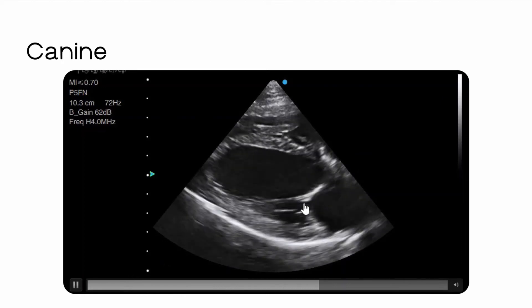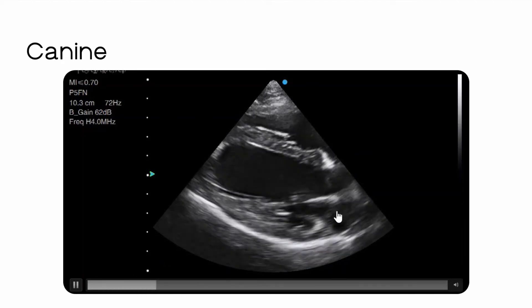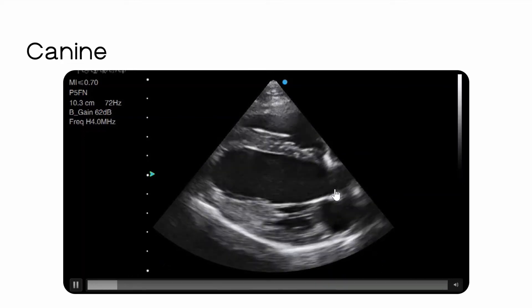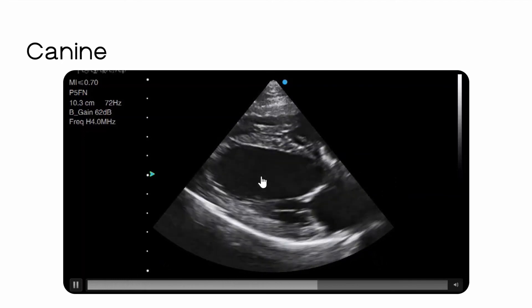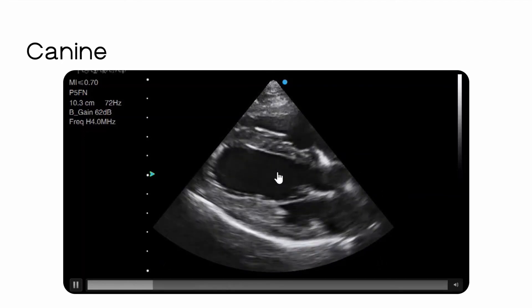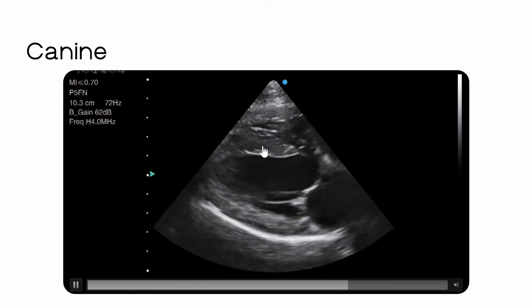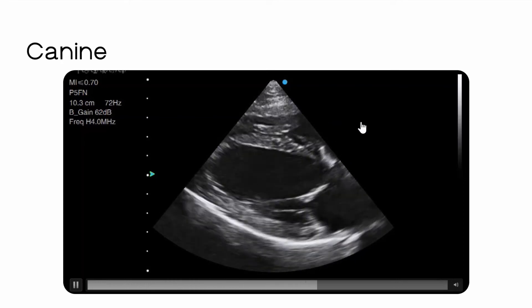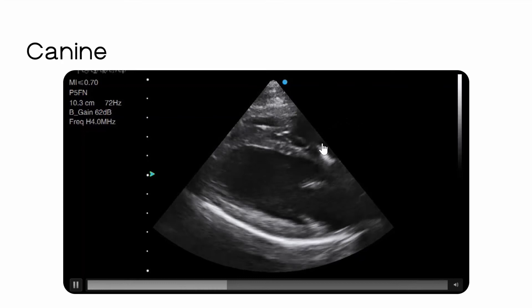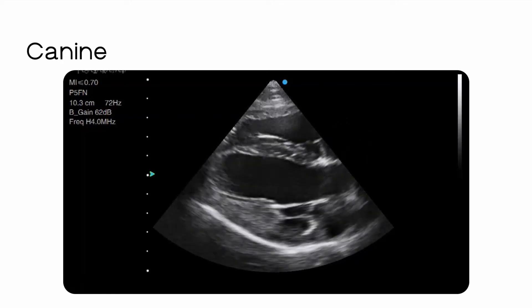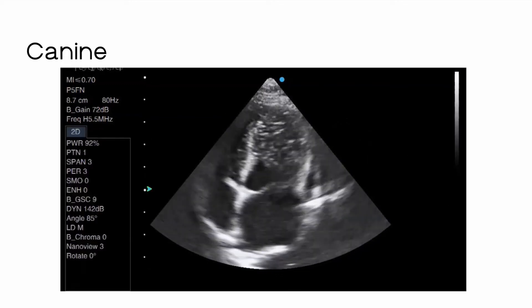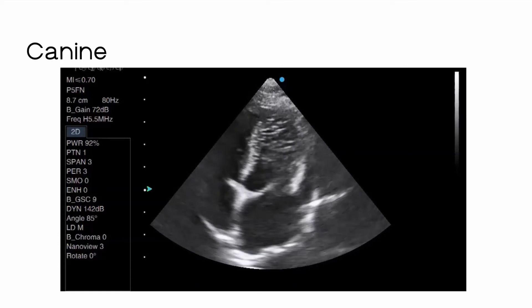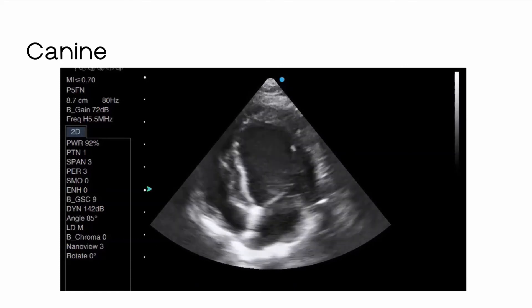So if this is the left ventricle, then the chamber feeding it must be the left atrium — blood coming in through the pulmonary veins, into the left atrium, through the mitral valve, into the left ventricle. Once you've figured that out, you know that on the other side of the interventricular septum is the right ventricle, and just off screen is the right atrium. Your right ventricle and right atrium are your more anterior chambers. Once you can confidently recognise the left ventricle from a right parasternal long axis view, you should be able to recognise it everywhere you go.